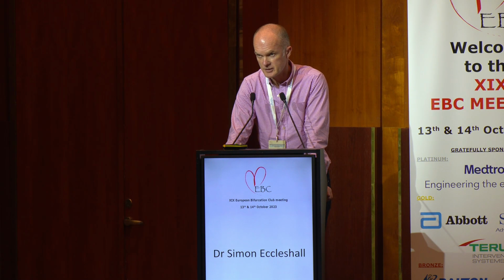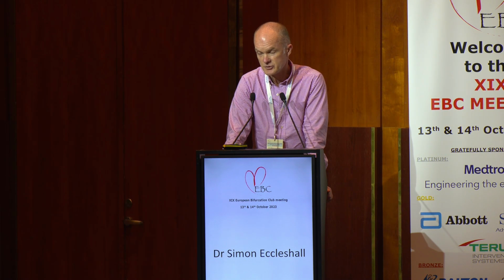So to my mind, the question is the same, whatever vessel you're treating. It's either a vessel-threatening dissection and needs to be stented, or it doesn't. There is no good data out there showing a prognostic benefit of routine stenting in all of your angioplasty. Stents were only invented for the reasons that you just said, for vessel-threatening dissection. When you take those patients out of the equation, there is no prognostic benefit, but there is an attrition rate forever of having a stent in that vessel.